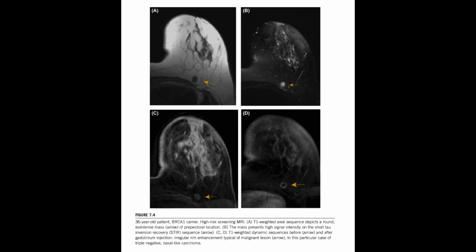And that's where kinetics comes in, the time factor. So kinetics is all about how fast the contrast agent washes in. And just as important, how fast it washes out. How does that reveal what's happening biologically? It's really measuring two things, blood flow and capillary permeability. Malignant tumors are aggressive. They build dense, disorganized blood vessels really, really quickly. So you can think of malignant tissue as being like a leaky, disorganized sponge full of huge holes. The contrast rushes in super fast. But because those new vessels are so porous, it immediately starts leaking right back out into the bloodstream.